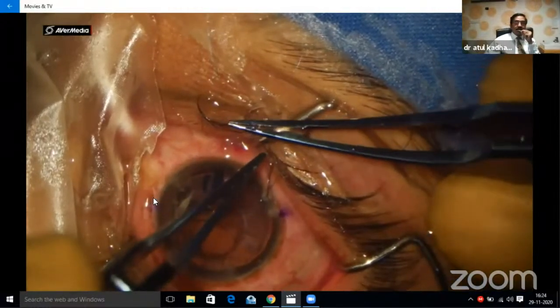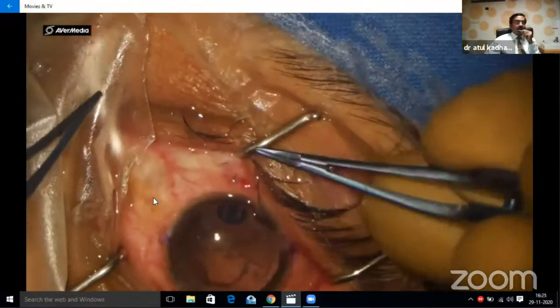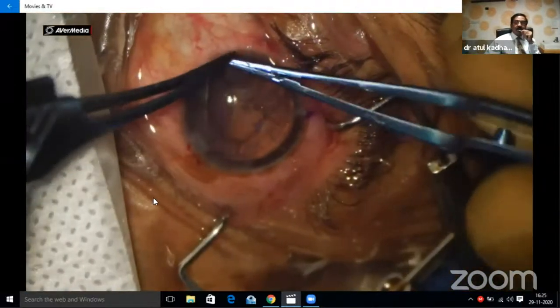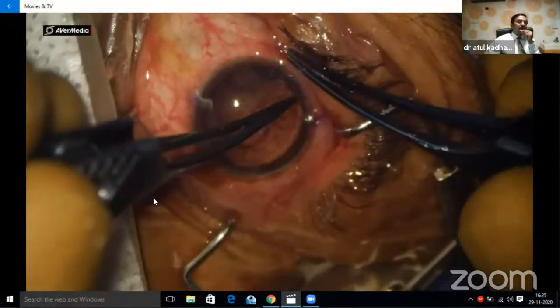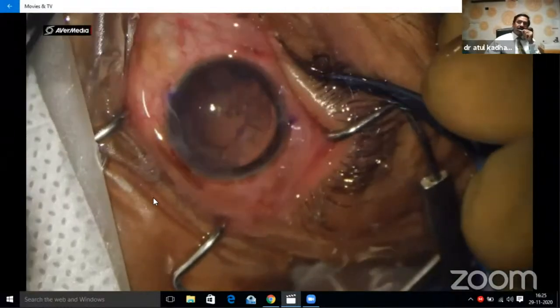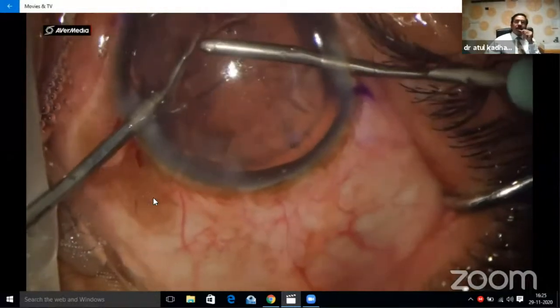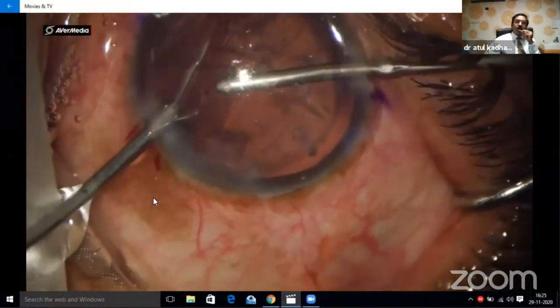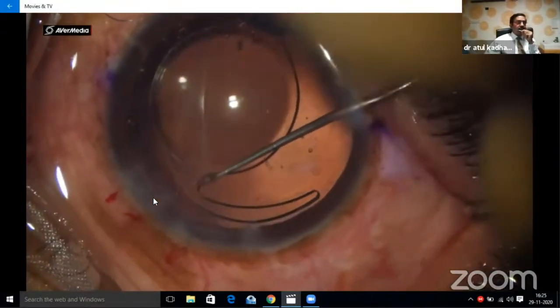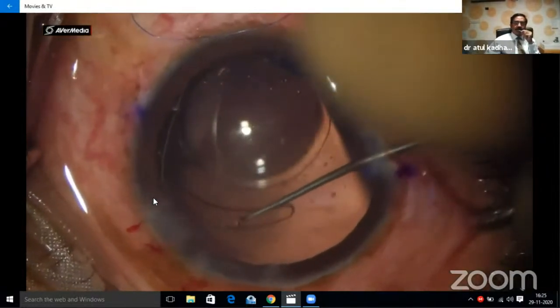The final suture knot is then tied in a 3:1:1 fashion, and it is buried in the sclera under the conjunctiva. Dr. Hoshi, who is the inventor of this implant, didn't recommend making scleral flaps for this. He said you can bury it directly under the conjunctiva into the sclera. Removal of cortex is in routine fashion with bimanual irrigation aspiration. I am routinely doing it, or whichever method you are comfortable with. Putting an IOL in the bag is also in the same fashion. Nothing great in that. Once the suture is done, the suture threads are cut flush to the knot.